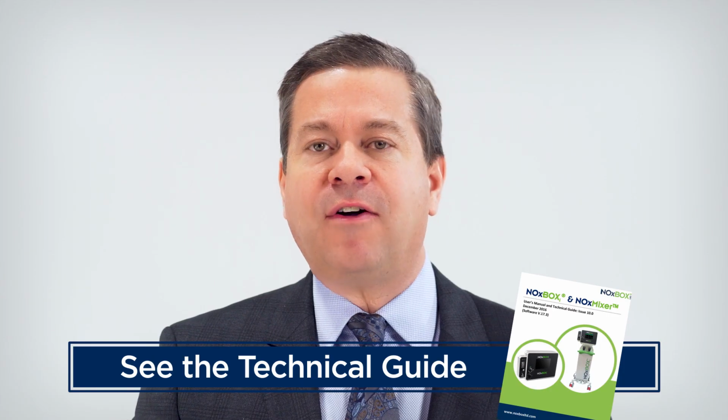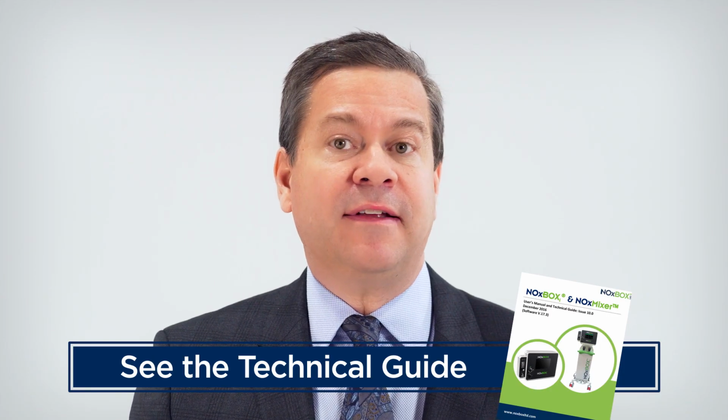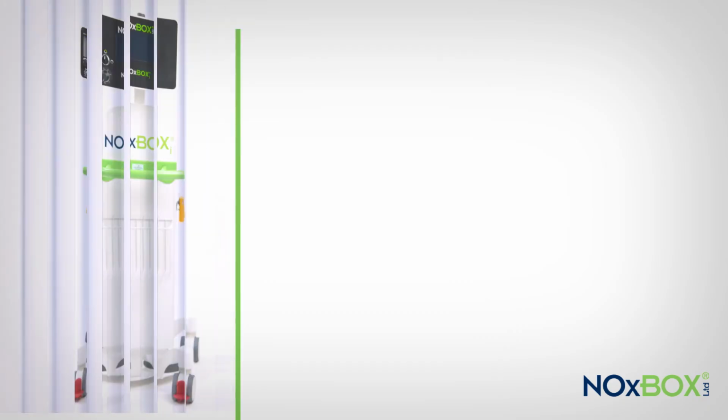Before using the NOxBOXi system, please read and understand all safety precautions as outlined in the technical guide. For additional safety and cautionary statements, refer to the cylinder gas instruction manuals and safety data sheets.